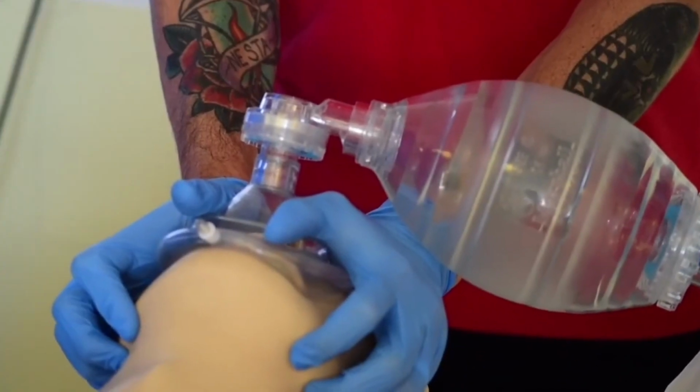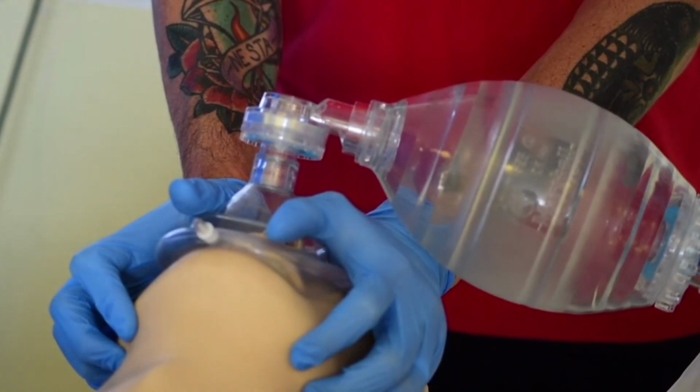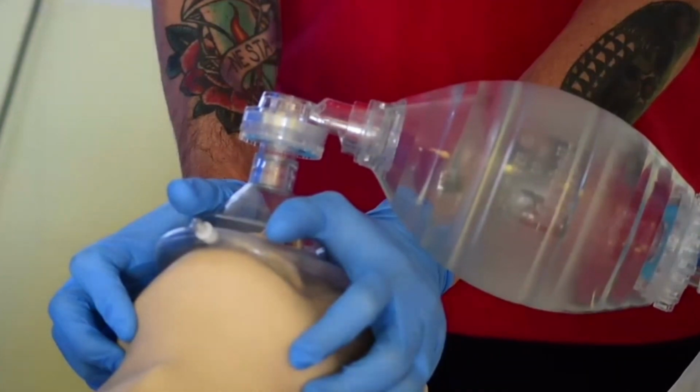The mask is placed over the patient's face with a narrow part over the nose and the wide part between the bottom lip and the chin. The rescuer's thumbs are placed on the hard upper part of the mask either side of the collar, pointing at the patient's toes. The other fingers grasp the jaw firmly. A good seal can be achieved by pressing the mask down and lifting the jaw up.